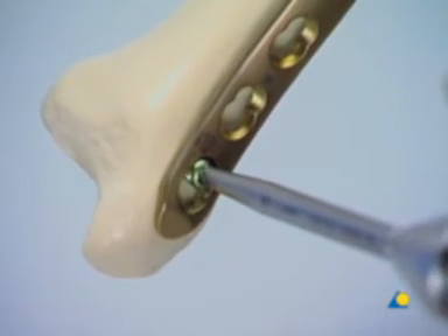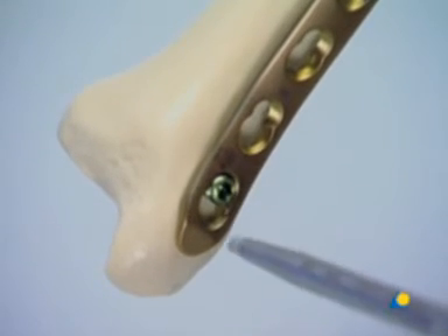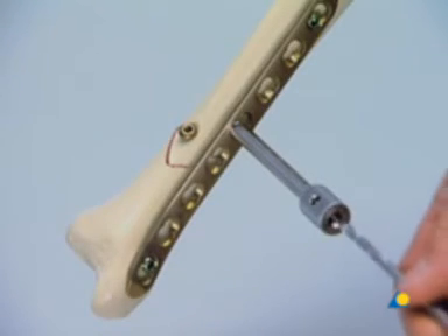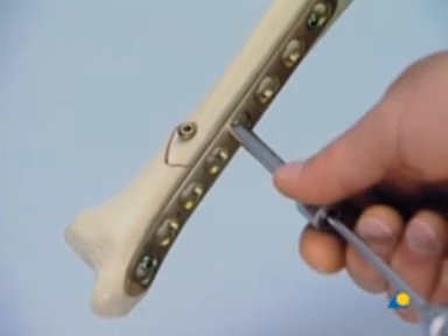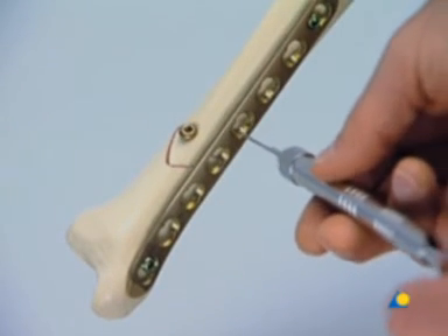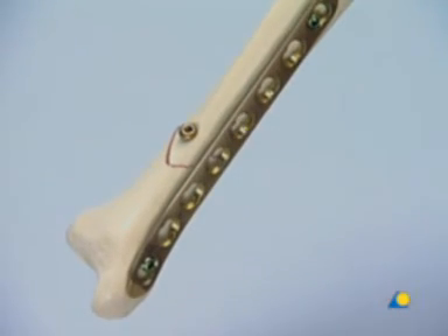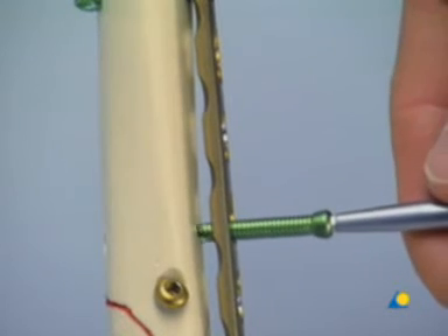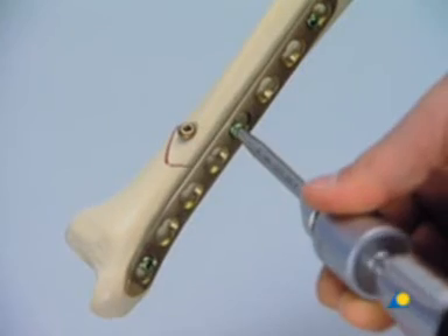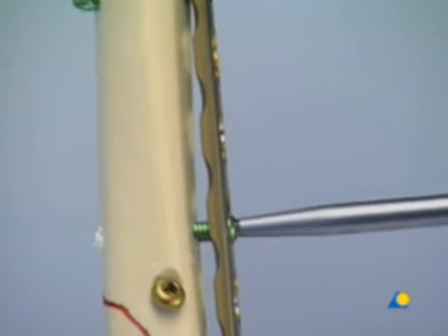The screw in the most distal hole is now tightened. The hole for the second bicortical screw in the proximal fragment is prepared. The screw length is measured and the appropriate screw is inserted. It's clear that the plate is not pressed against the bone, leaving a gap for the periosteum and healthy tissue ingrowth.